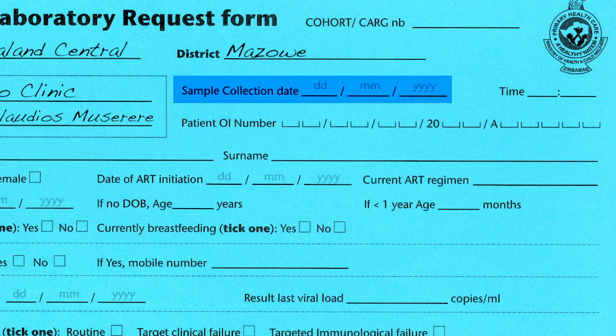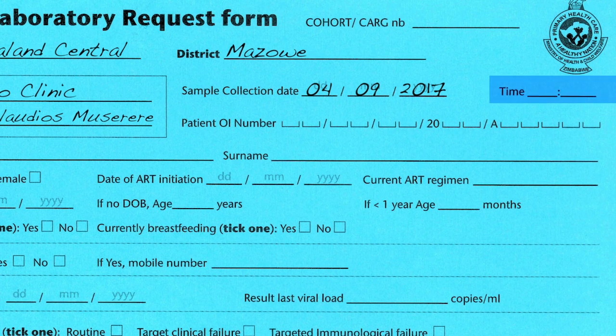In the DD field, you write 04. In the MM field, you would write 09, since September is the 9th month. In the YYYY field, you would write 2017, not 17. In the time field, enter the time you collected the sample. In this example, it's 09:14 AM.